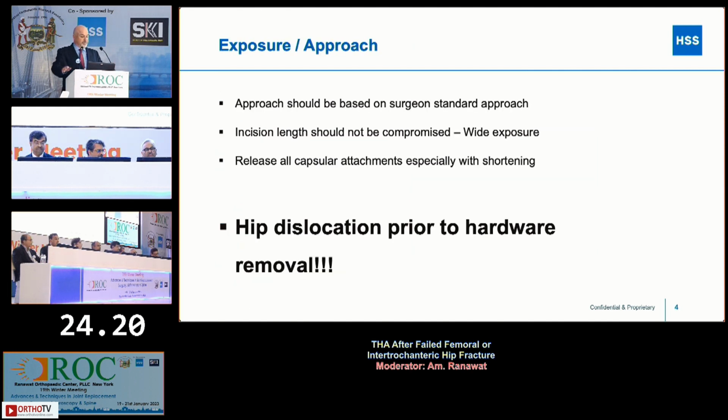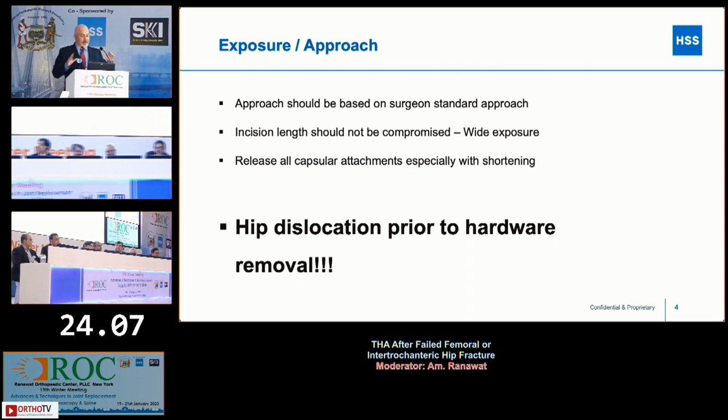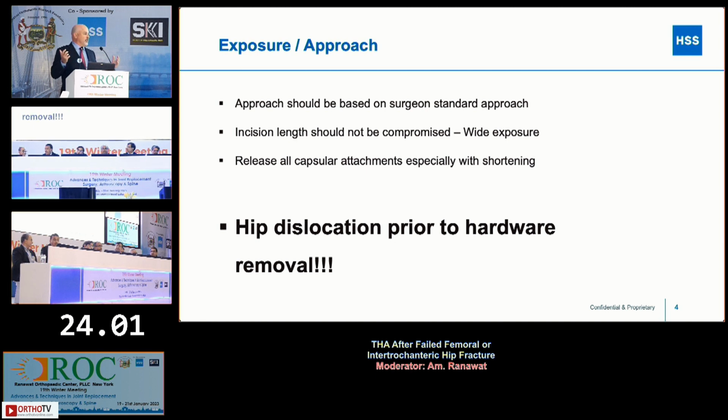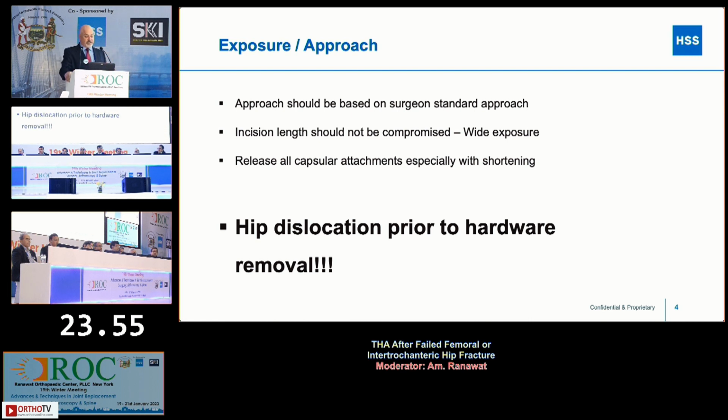So let's talk about exposure. Who's going to do the posterior approach? Raise your hand. All right, looks like most of the panel. Who's doing the anterior approach? One. All right, I'm not going to pick on you. But I think the point is the incisions should not be compromised. These require wide exposures, right? There's often shortening and capsular adhesions and things, so you have to do that.